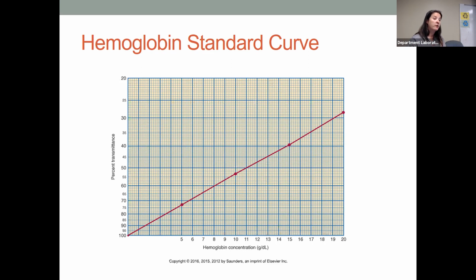After the white cell count is obtained, there's a little cuvette. Your sample is going to drop down into the cuvette, and the spectrophotometry reading is going to occur there. And that's how it gets your hemoglobin reading. That's just a little further on. We have a whole section of automation coming up, so you don't have to know that right off the bat.